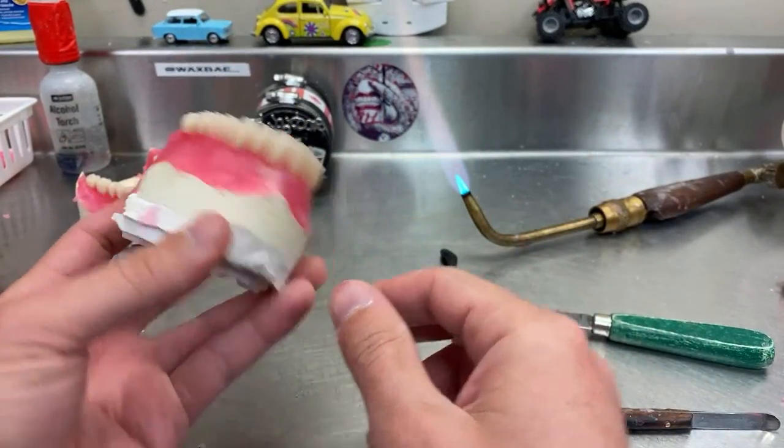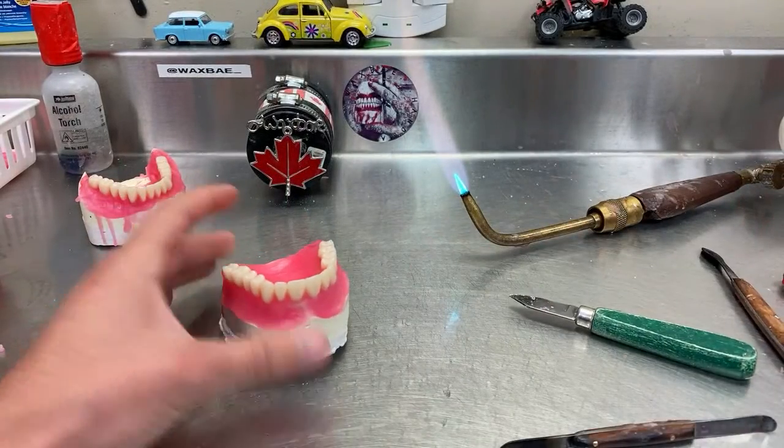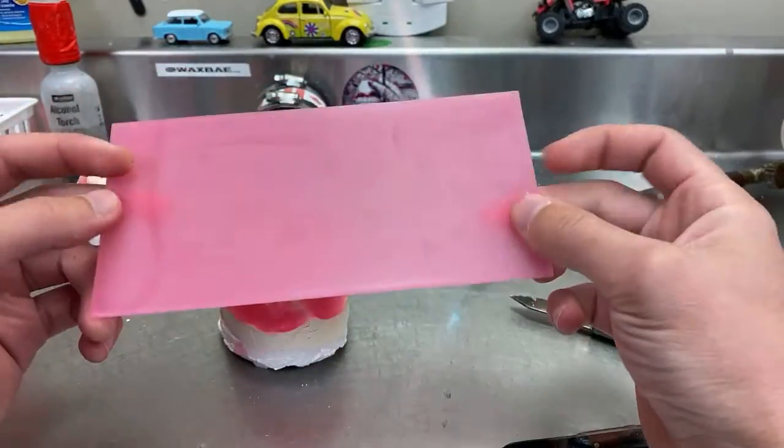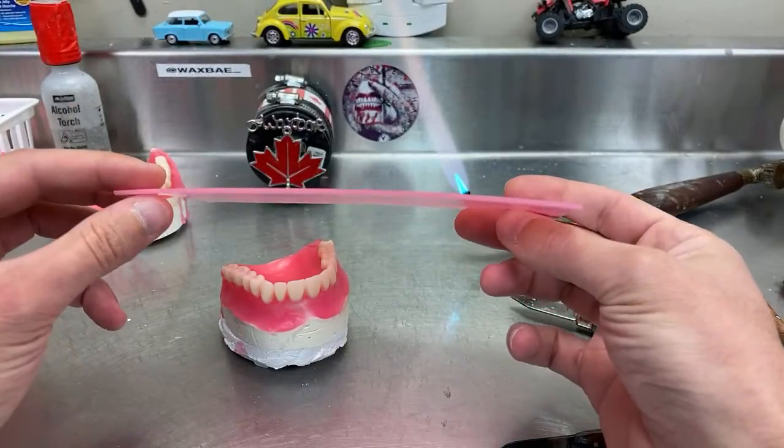Okay, so now it's heated. Don't heat it too much because you don't want to distort the setting or the teeth. Regular base plate wax. It's really nice at room temperature. It's hard.